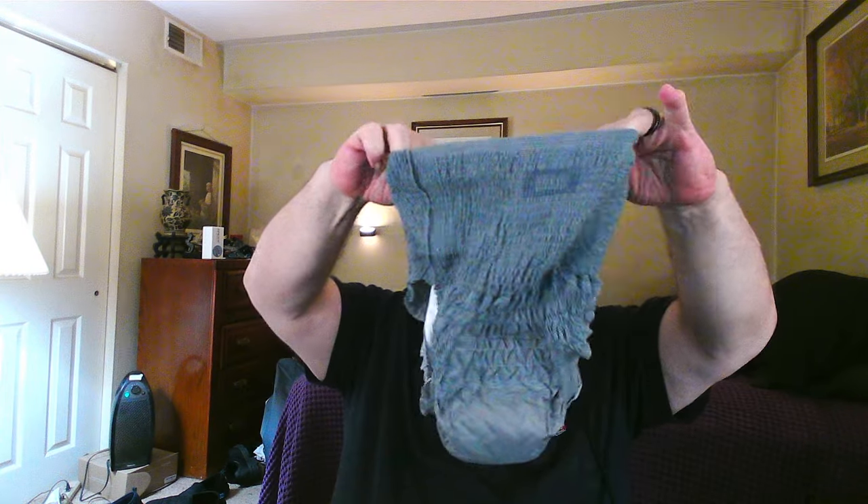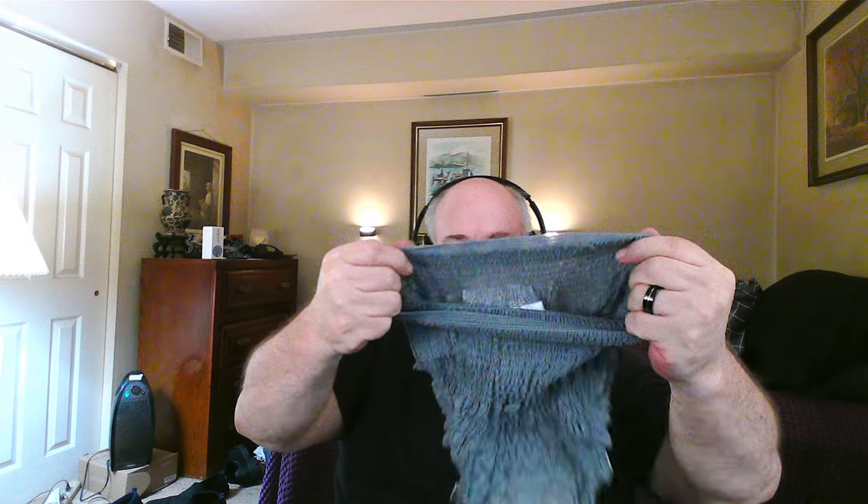Now these are adult pull-ups. They don't tape on the sides like baby diapers do. I say diapers a lot and that sort of pisses them off — the elderly people. But it's an adult pull-up. You pull it up and there's no tabs.